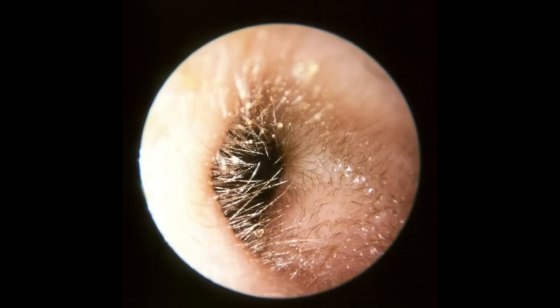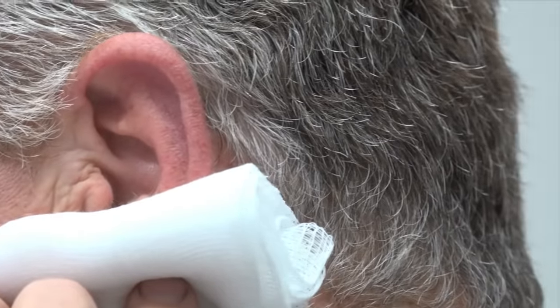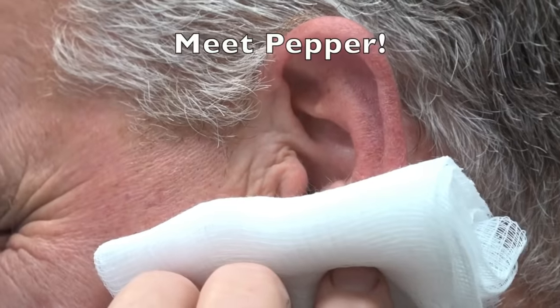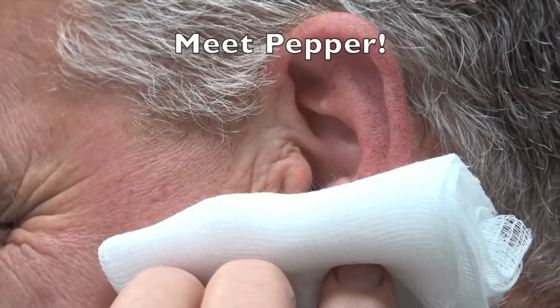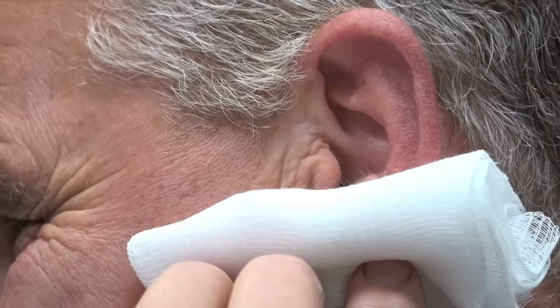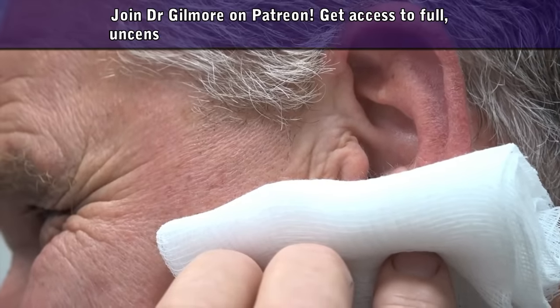Thanks for letting us video your procedure. We've got our friend Pepper here. Pepper, do you mind if we video your procedure here for YouTube and the internet? No, you don't mind at all. You've had a little trouble with your ear for a few weeks, you were telling me, correct? Yes.